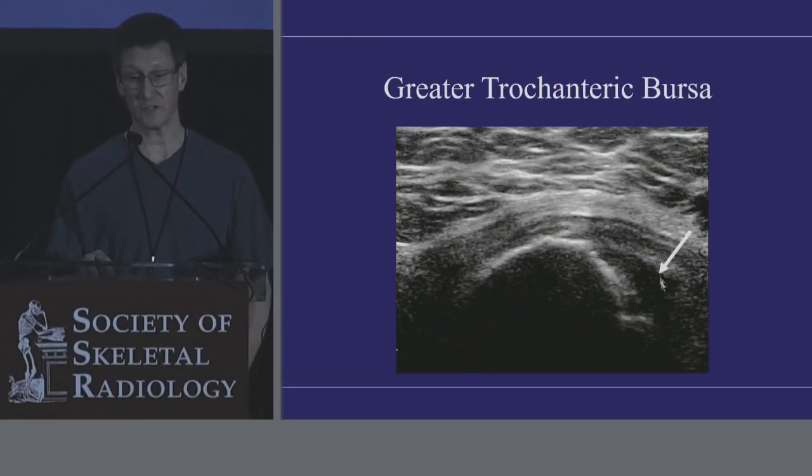Sometimes if you scan a patient, you'll see a little bit of fluid collecting more posteriorly. That's in the dependent portion of the bursa. And again, you see your iliotibial band very nicely sitting on top of your abductor tendons.